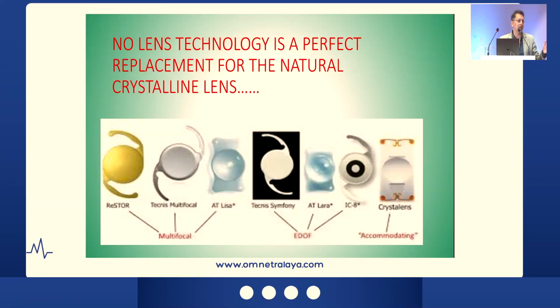So whenever you have a patient, I think these are a few tools which you can use to check the exact aberration profile in that patient and find out the exact reason for the patient's dissatisfaction. Because sometimes, as I said, tear film or corneal problems or decentration of the IOL may be the major problem causing the aberrations and not the IOL itself.